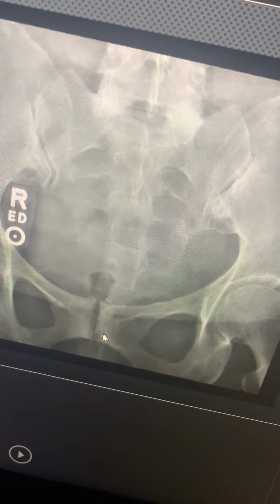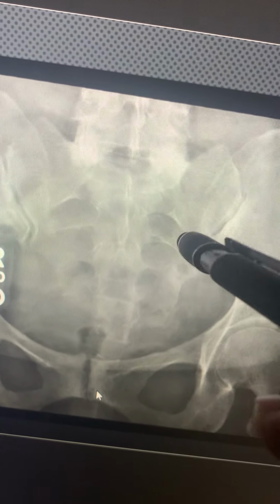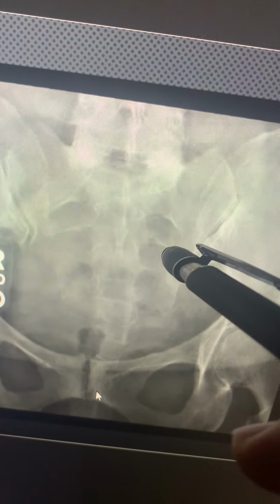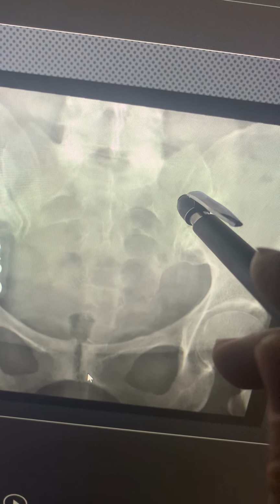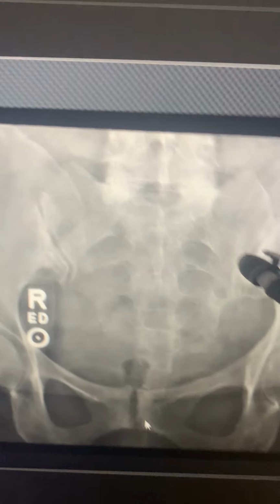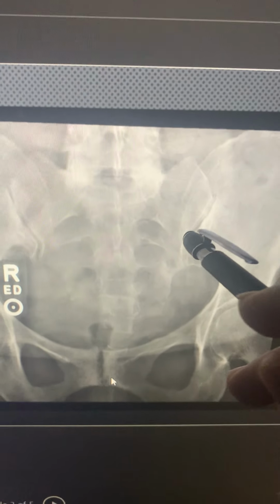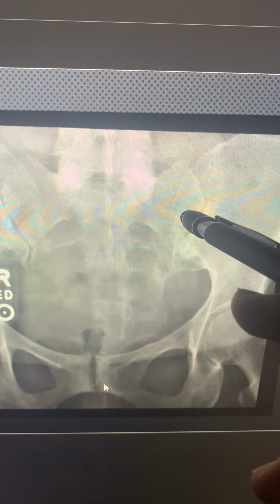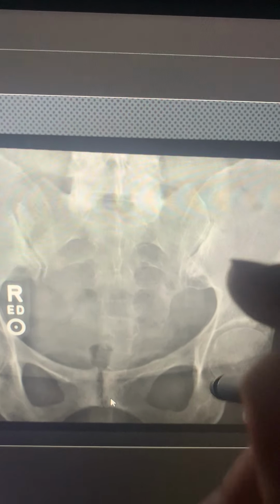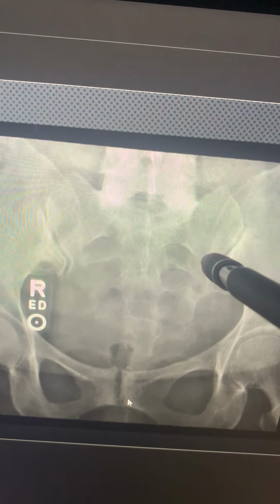So this shows decent density and kVp. I did have to technique this radiograph since the AEC ion chambers were all disconnected, so this was all manual technique. For this technique, I ended up using 85 at 25 or 24, 28, somewhere around that. The digital Carestream likes to jump around from a lot to a little, and it doesn't allow precise increments. But it was 85 at 24, I believe.